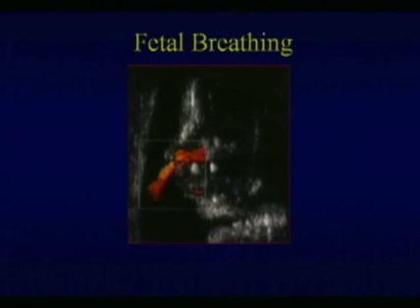We can see the trachea if we look carefully, and certainly we can also see breathing through the mouth and the lips. This can be helpful, for example, in excluding unusual conditions like choanal atresia. In that case, we wouldn't get this normal respiratory movement through the lungs and through the nasopharynx as we see here.